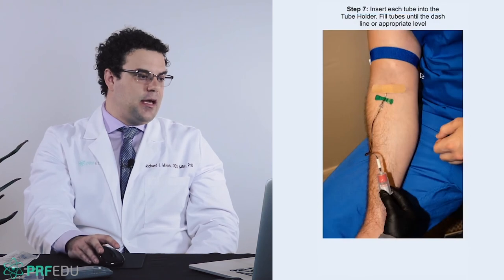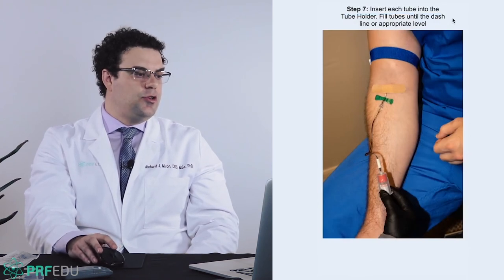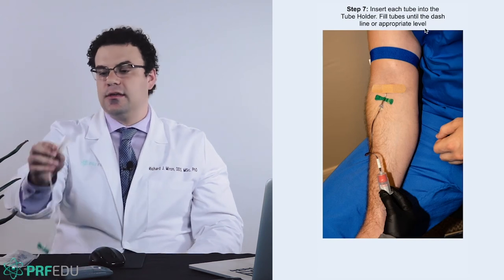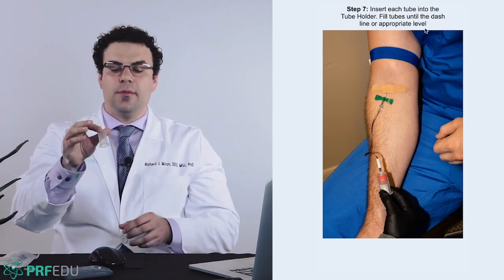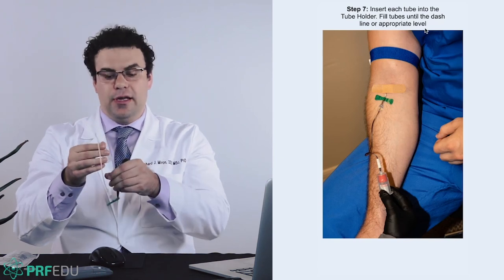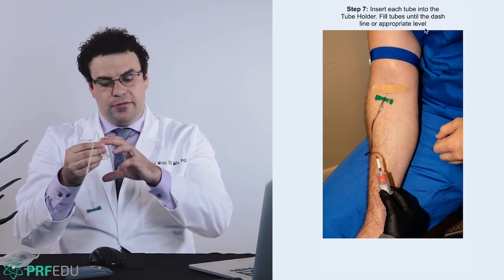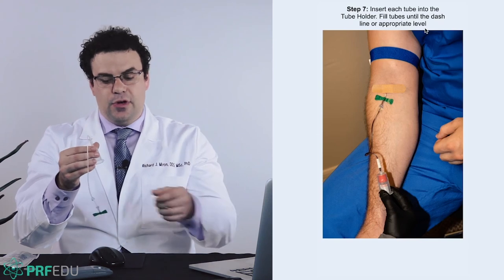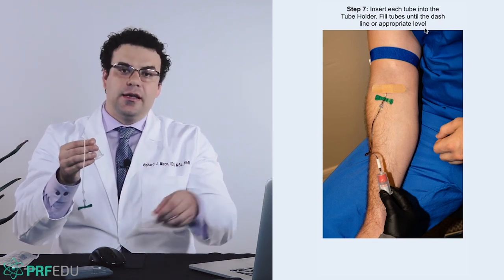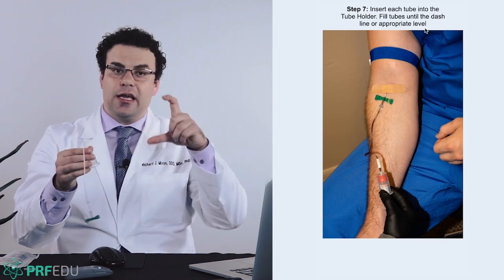Step 7, okay, you're going to start inserting each of the tubes. Always remember that whenever you put the tubes inside the butterfly cup holder, make sure that they're well secured. So you put it in, you hold it, you let it fill up 15 seconds, pass it to maybe your assistant or somebody else you're working with, next one goes in, and keep it going. Remember that there's a vacuum in there.